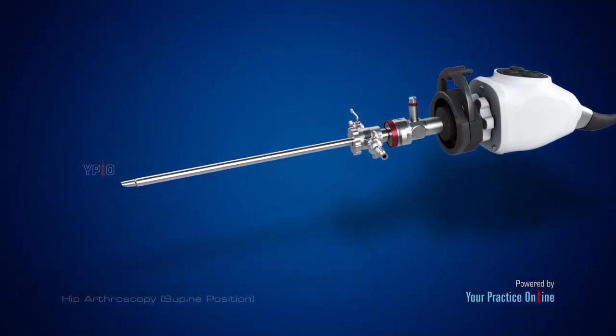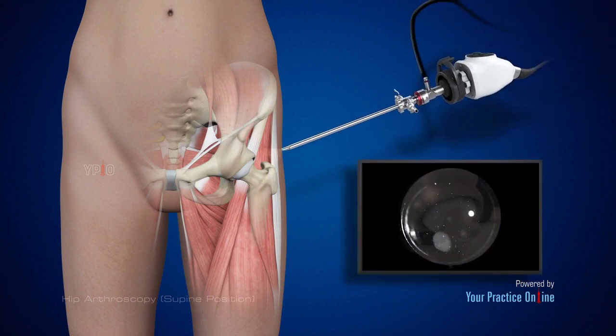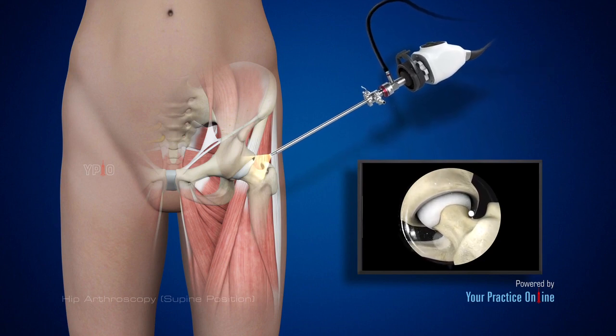The camera projects an image of the inside of the joint onto a large screen monitor, allowing the surgeon to look for any damage, assess the type of injury, and repair the problem.